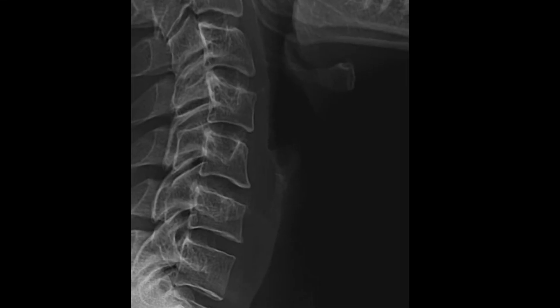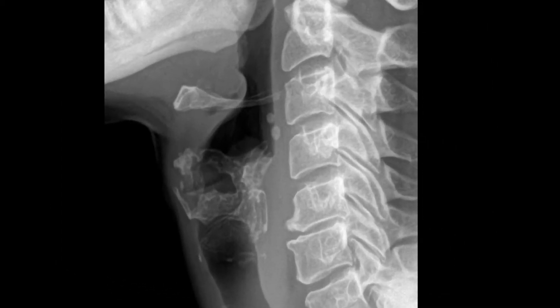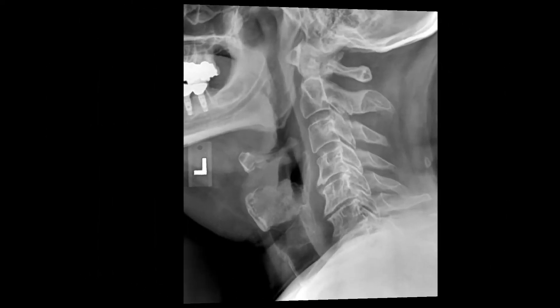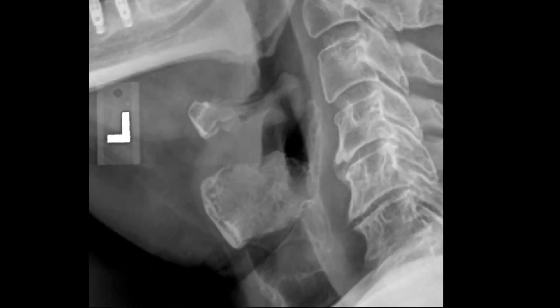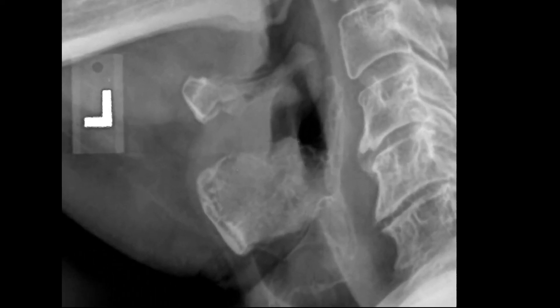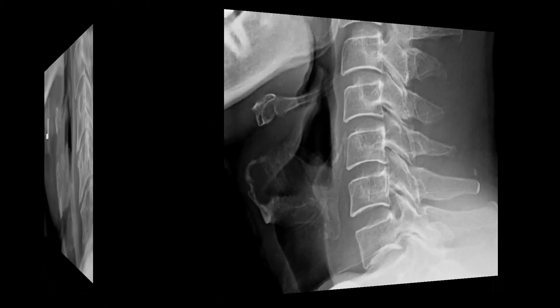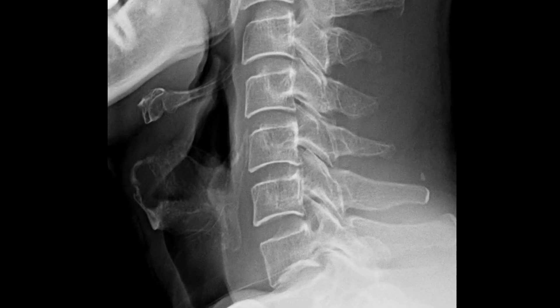When we zoom in we can confirm this is a totally normal finding. This presentation also looks alarming but it's normal physiologic calcification. Here we have the hyoid, the laryngeal and thyroid cartilage calcifications, cricoid cartilage, the arytenoid cartilage, and the corniculate cartilage. On this example we can see a large density anterior to the neck — also normal physiologic calcification. On this patient you can see very prominent yet normal thyroid and laryngeal cartilage calcification.